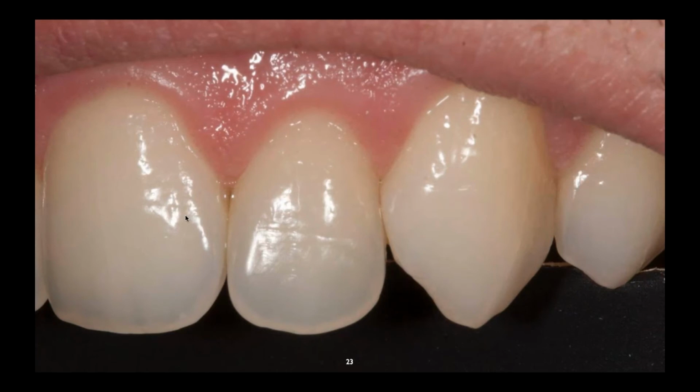So if you're having difficulty trying to figure out a natural setup, just like the old denture teeth from VITA, the laterals would be different than the canine and the centrals. And these are very thin teeth, so they're almost more translucent, so they're a little bit lower in value. Remember, the more translucent something is, the more gray it's going to look. And so the central incisor and the first bicuspid are almost identical in shade every time. The canine obviously is a thicker tooth, and it needs a little bit more chroma, and they're usually leaning towards a yellow.